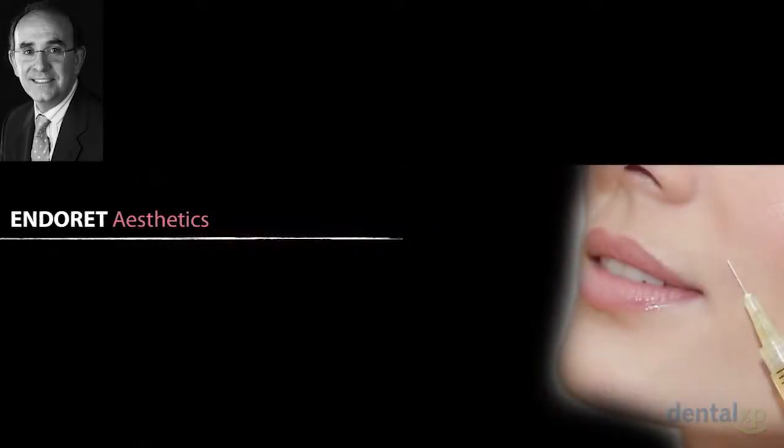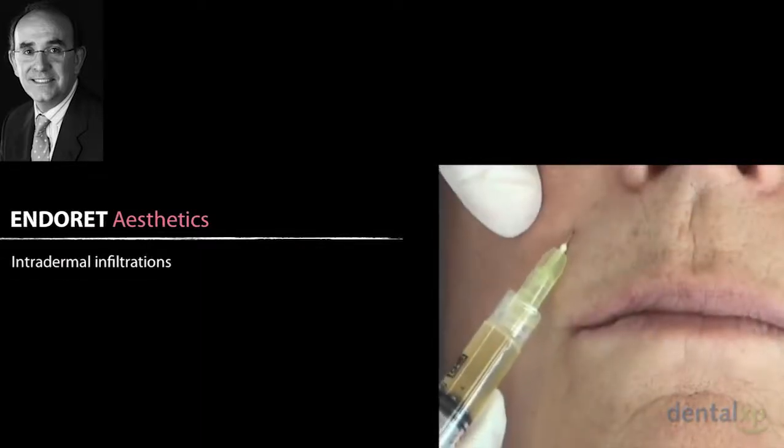But what about, if I reconstruct the bone, I improve the lip support? Is it possible to do something more in these cases that have severe resorption? In the last 10, 15 years, I am doing a lot of research with dermatologists to treat ulcers, to treat different injuries, and the protocol to increase the volume of the skin, I think that is really interesting.